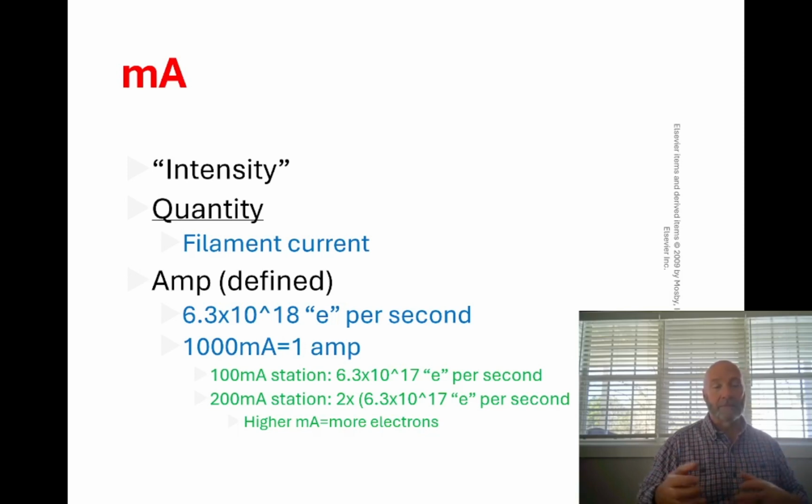It's got an MA selector, which is kind of like the auto transformer in that you can increase or decrease the intensity through that. It comes out of that and it goes into a step down transformer to reduce the voltage before it goes into the x-ray tube. The amperage is totally unrectified before it gets to the x-ray tube.